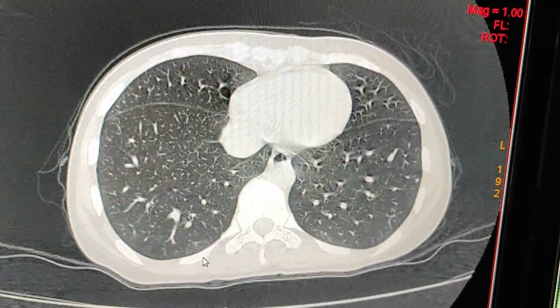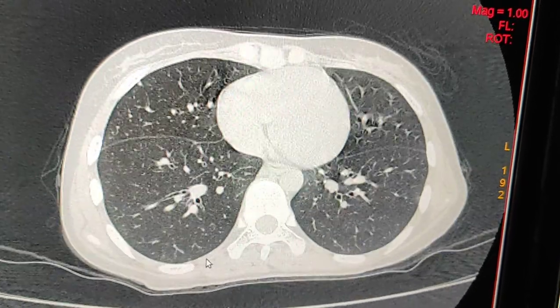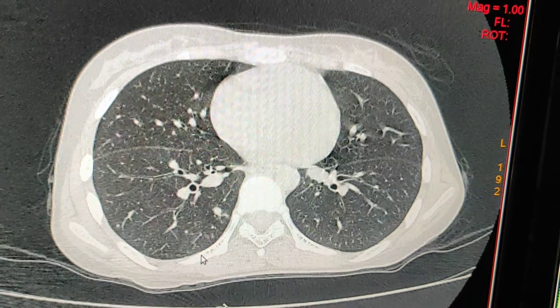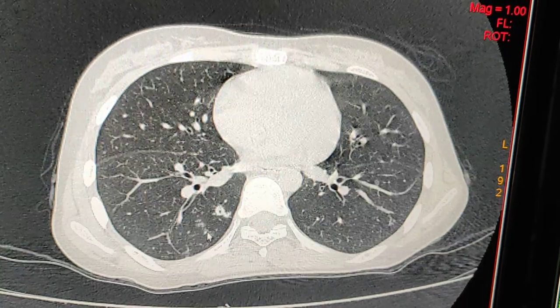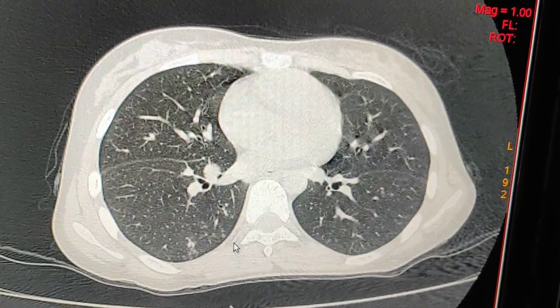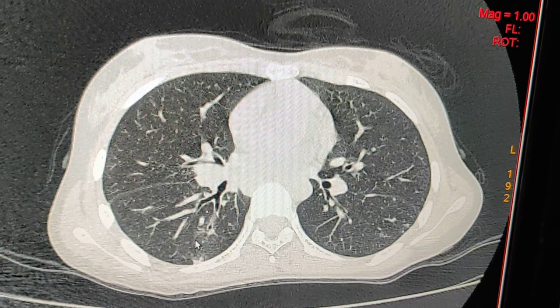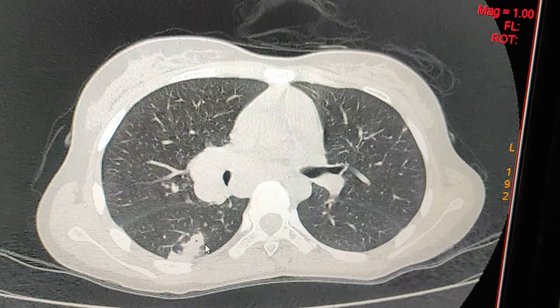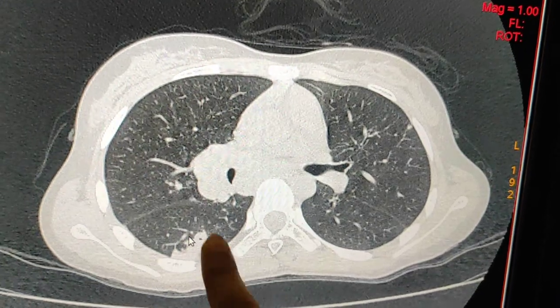In this axial image, you can see the small nodules in both lung fields. This is a small nodule, and this is a cavitary lesion — you can see this one.